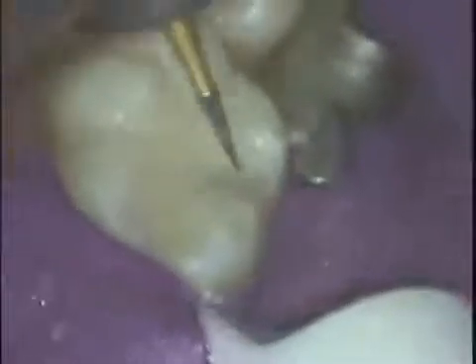Here the Estelite Sigma is finished and proper occlusal anatomy is sculpted using a carbide fluted finishing burr with copious water and irrigation. Primary and secondary anatomy is formed in the occlusal surface, is then finished and polished, followed by checking the occlusion.